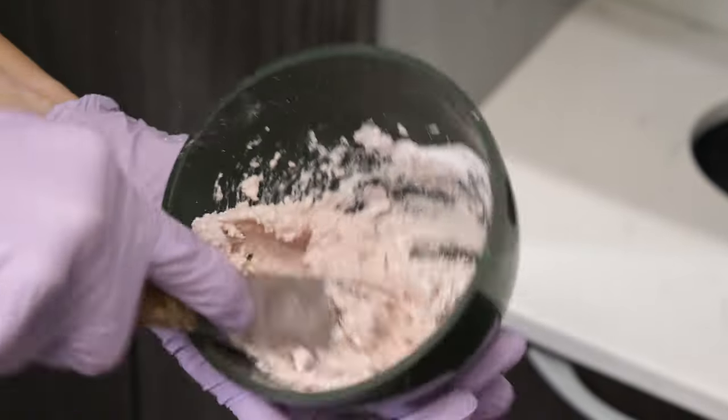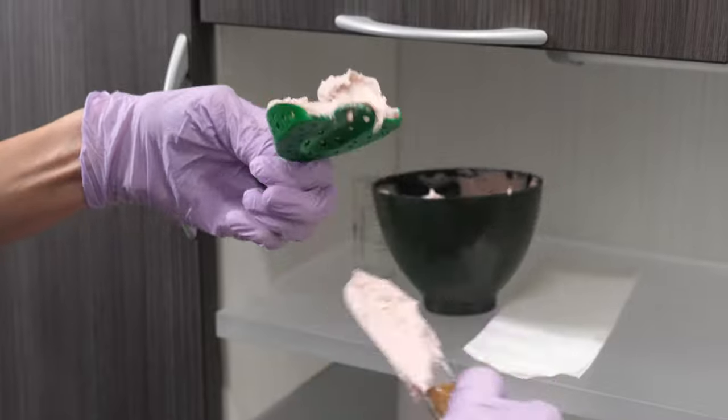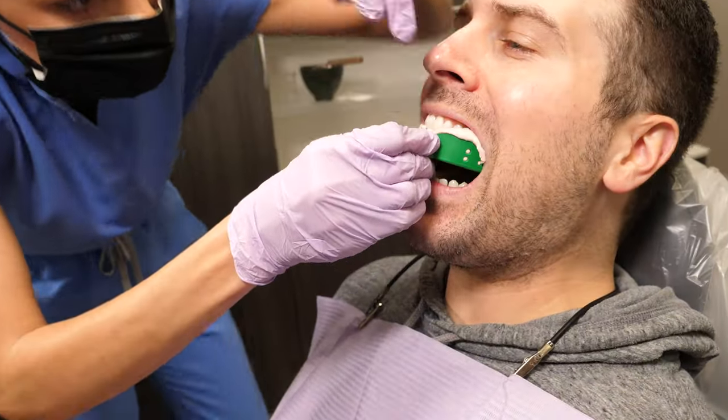Once it's mixed, they put it onto the tray and they will right away put it into your mouth. Don't bite down — they will press it up.